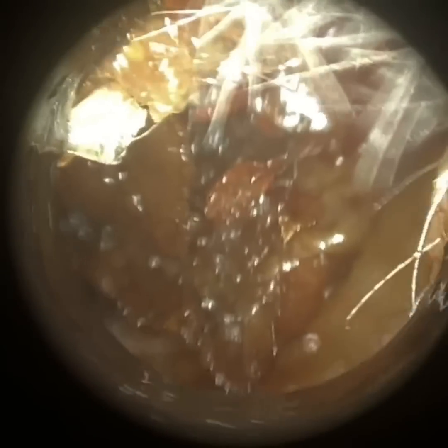So slowly but surely, we're getting deeper in the ear, and I'm using our medium-sized speculum, a 4.25 millimeter internal diameter.